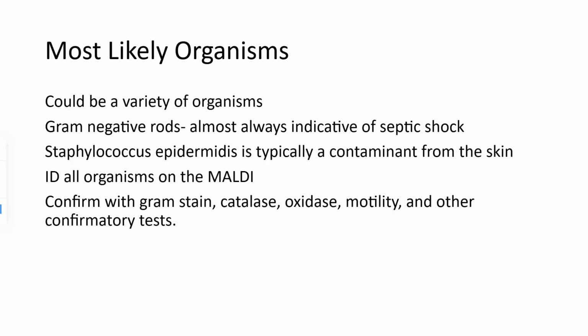Also, if plates get mislabeled or specimens get moved around in the lab, or techs add the wrong notes to the wrong patient by accident, mistakes can happen. Having multiple confirmatory tests can allow us to track those and prevent us from reporting incorrect information to the physician.